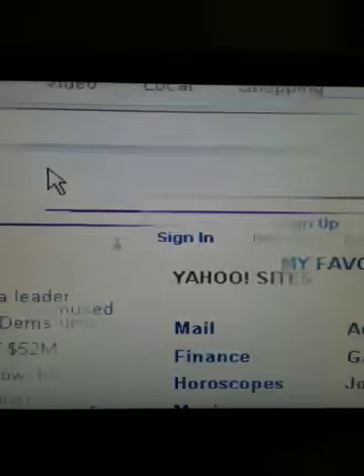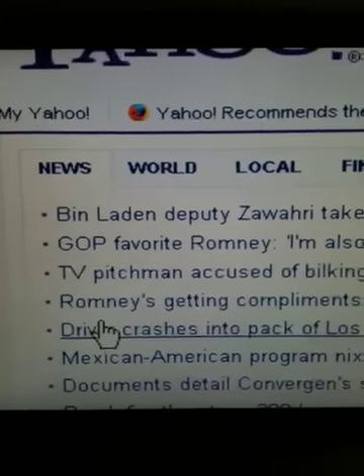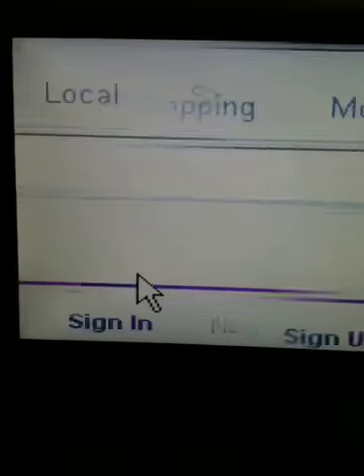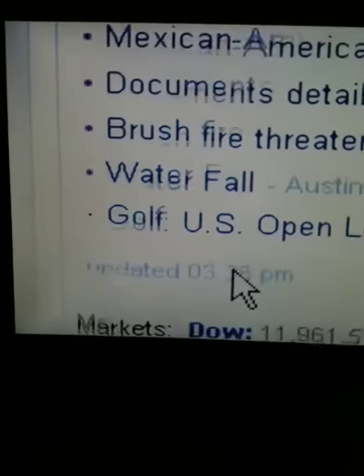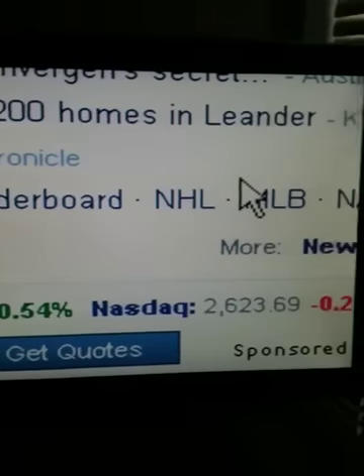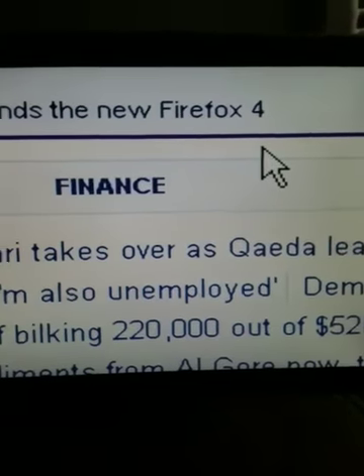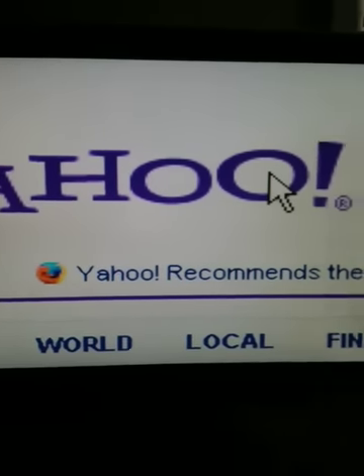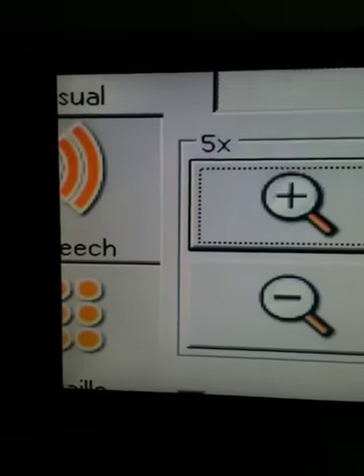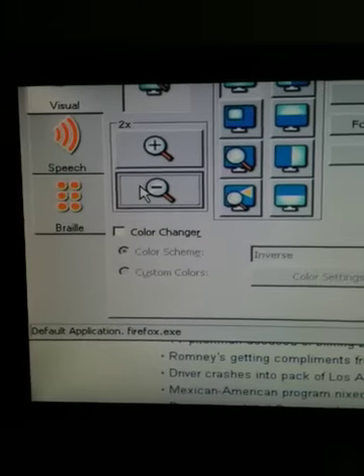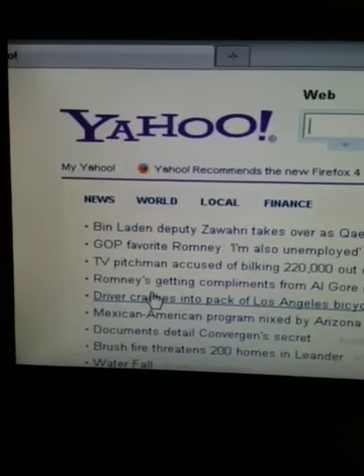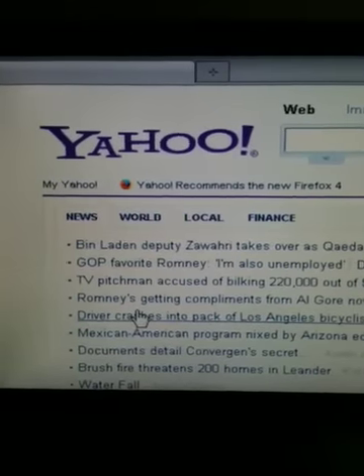Basically this is actually just like a CCTV that people with vision impairment will use to read books — the same thing, but on a computer. So I've got the internet. I'll make it a little bit bigger so I can see some differences. We'll go times five. Real big. The higher the magnification, the less of the screen you'll see. This is a widescreen monitor. Yahoo. See, it takes almost all the screen because it's so big. What I'll do is take it down to times two and get more of the screen on there. It is smaller, obviously, but it's good technology. Have a good day, y'all. Thank you.